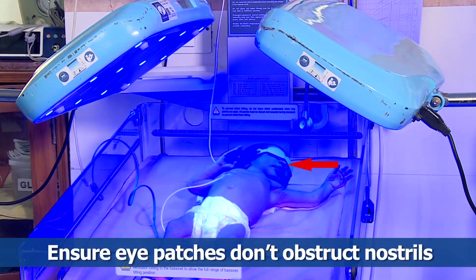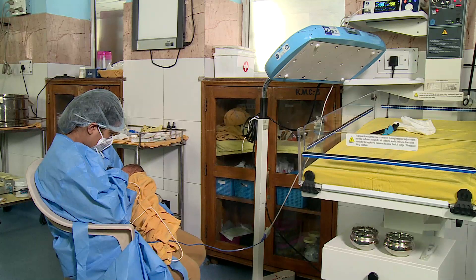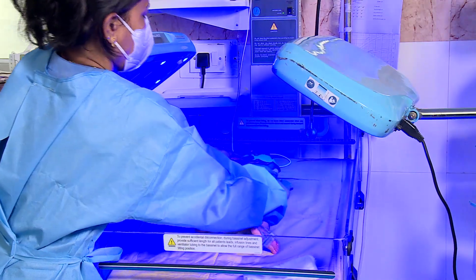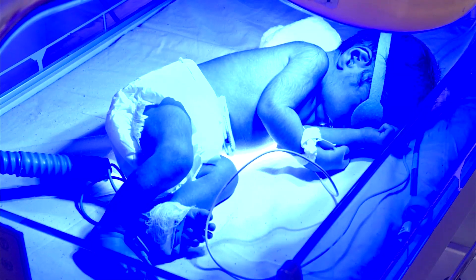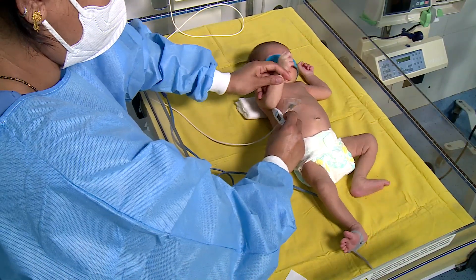Ensure eye patches don't obstruct the nostrils. Encourage the mother for frequent breastfeeding and changing the baby's position after each feed, to expose all body parts to the phototherapy light.